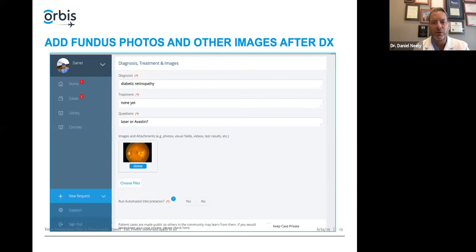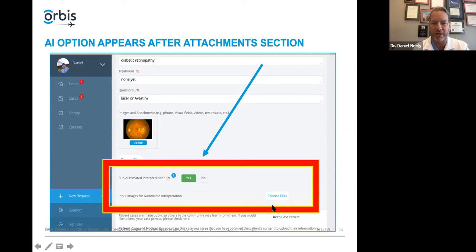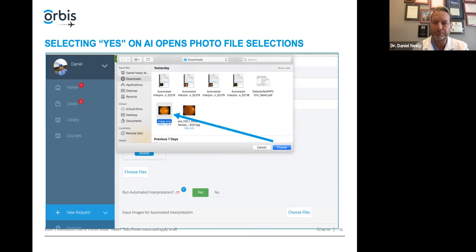Once you have that attached, just below that is the AI selection section — it says 'run automated interpretation.' You don't have to do this, but if you select yes, it becomes highlighted and allows you to choose your files. When you select yes, it opens up your file browser and you can go to the fundus image or images you want. Usually it's going to be a left and right color fundus photograph. You select those, upload those, and you'll see the image is now attached in the AI section as 'input images for automated interpretation' — that's the image that will be analyzed.